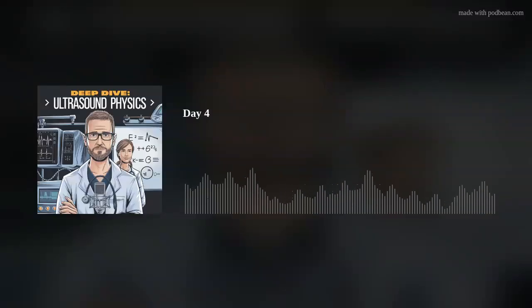What's the alternative then, especially if you need to know exactly where the flow you're measuring is happening? The alternative is pulsed wave Doppler, or PW Doppler. This type uses just a single crystal in the transducer, which alternates between sending out a short pulse of ultrasound and then listening for the returning echoes. Sending and listening back and forth. Exactly. And the huge advantage here is range resolution. Because it only listens during a specific time window after sending the pulse, the echoes it analyzes come only from a very specific small region along the beam path.